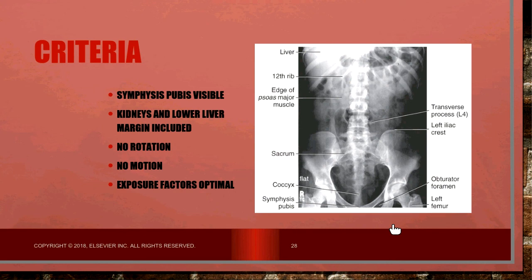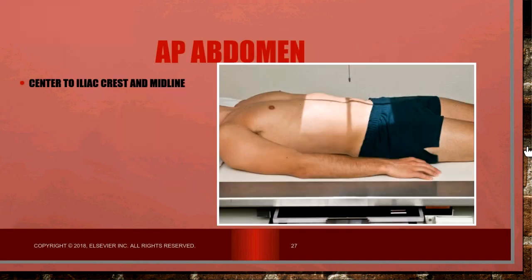All right. Now, the other way that you could do this, if your patient did not look like this particular patient right here, and they were not going to fit on one image receptor lengthwise, what you could do, if you look on page 118 at the very bottom, underneath respiration, it says notes.